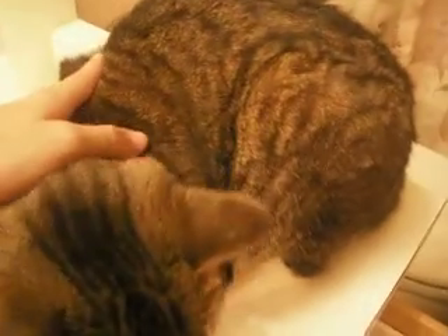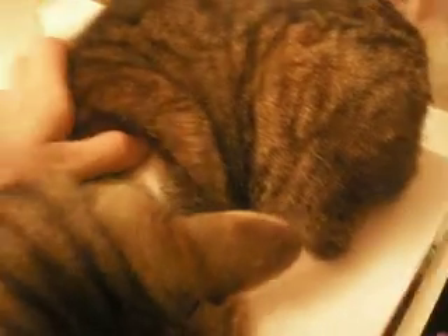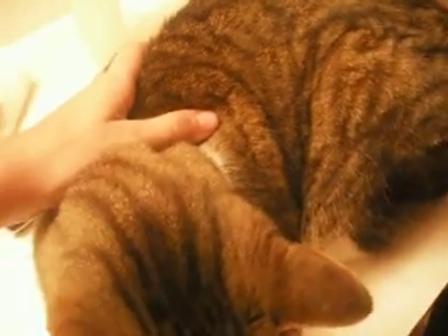I'm going to give him his fluids right now. They have free skin — a lot of free skin — here on top of the shoulder blades, so you just have to lift this area. See how they have a lot of free skin?